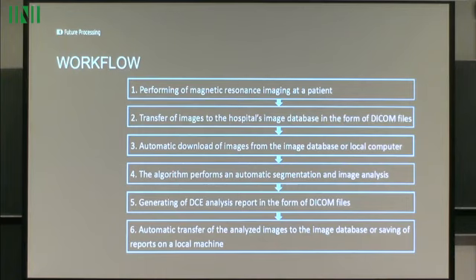So we have a DICOM report that will store the results. But it's not only the final results, so it's not only one single number, but the results that we achieved during the processing pipeline. That might be, for instance, segmentation. And finally, if we have this report, we may store it back in PACS, or we may analyze it locally and just not push it back to PACS.